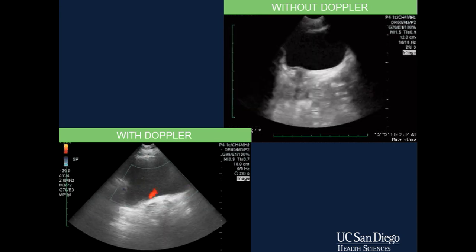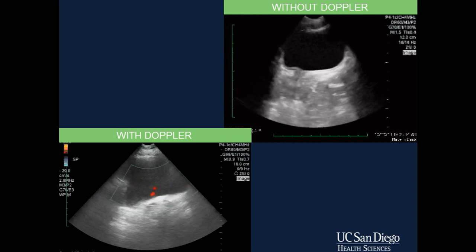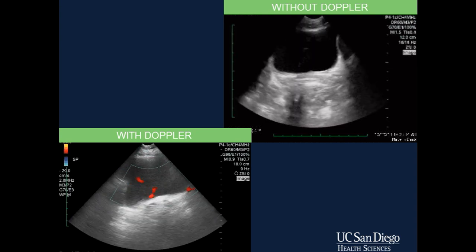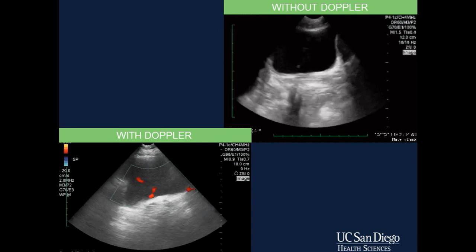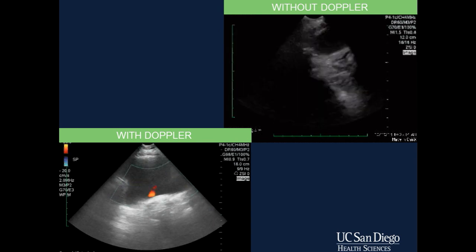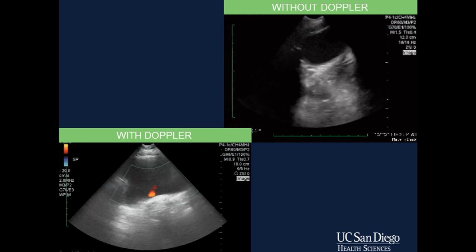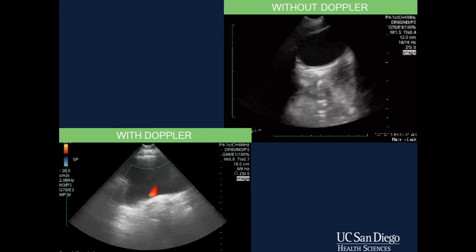In the bottom left-hand corner of the screen, you can see the ureteric jets on color flow. They point obliquely to the opposite side of the bladder and occur intermittently, often several minutes apart. The presence of a jet excludes complete but not incomplete obstruction. The absence of a jet suggests but does not prove obstruction.